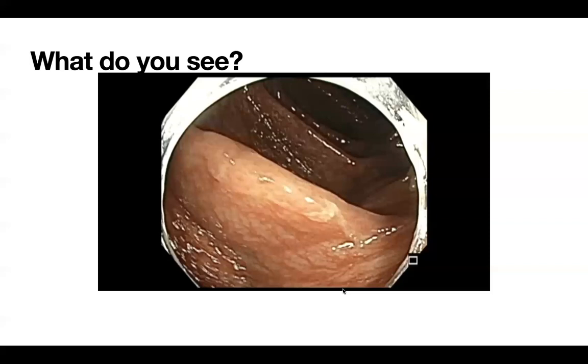Suddenly you're converting an elective case into an emergency surgery. So that's my impression based on doing this lady's case, because I also had trouble maintaining a stable position initially. I had to struggle quite a bit to get to that stable position. And once the scope was in a stable position, then the rest of the steps were relatively straightforward.